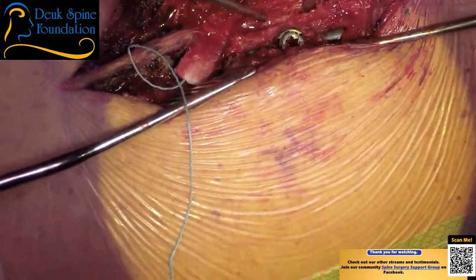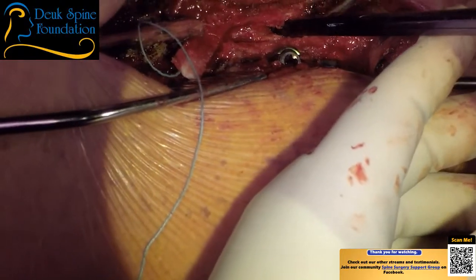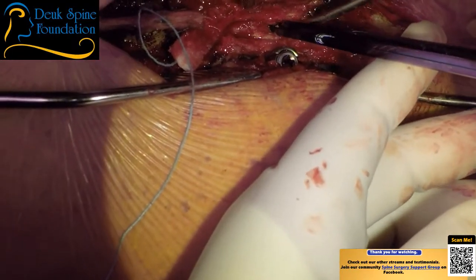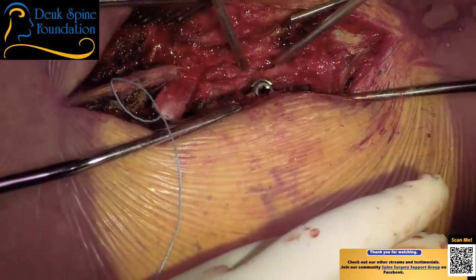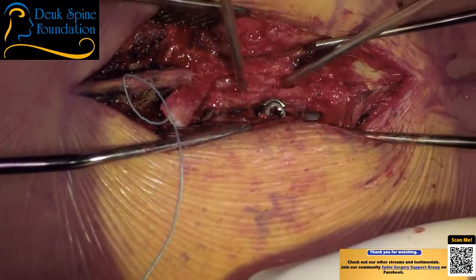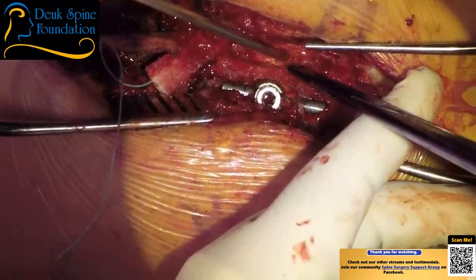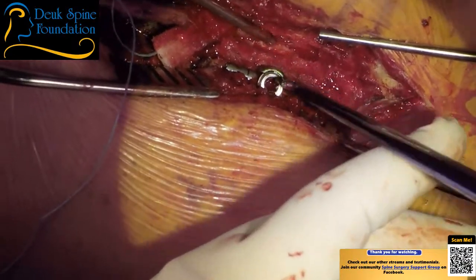That looks good there. We just need to look across this area right here. Yes, looking good. I'm going to open this up just to the side a little bit. Show me. This is all thickened ligamentum flavum, the yellow stuff I'm biting out, and some bone. The bone really isn't the problem. It's this thickened ligament, which still is on my side. I'll show you. Can you guys see that okay? See that thing right there of ligament? And that's just crushing the spinal cord.